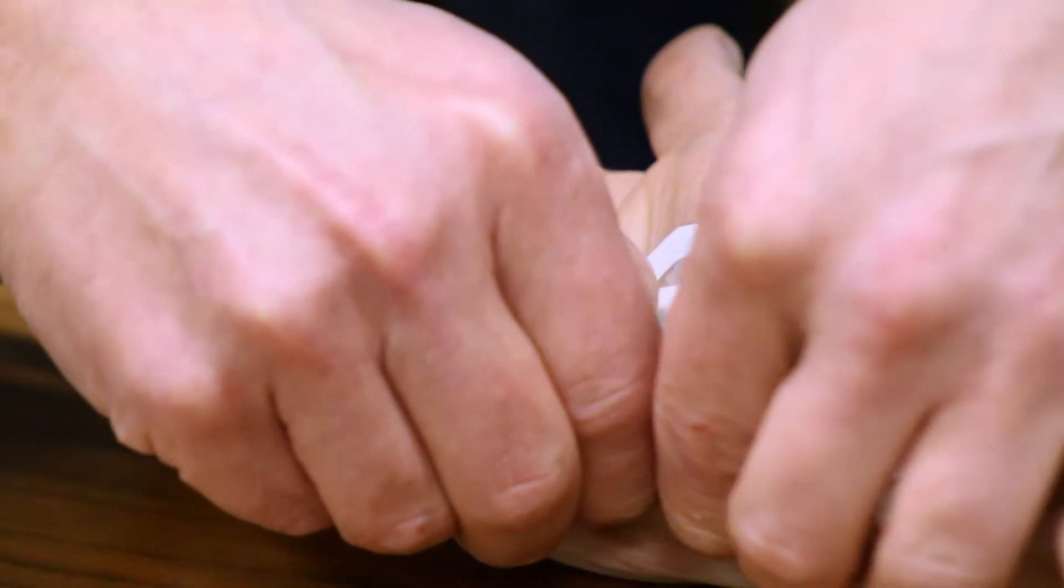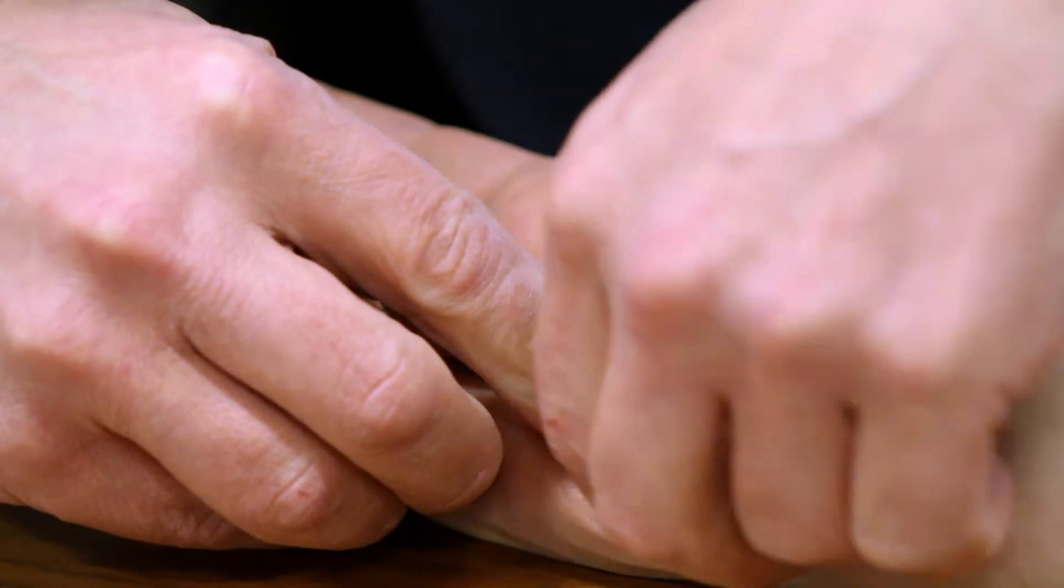And then we just have this little device to help us apply it nicely. You can have these at home, and you can apply them yourself at home.